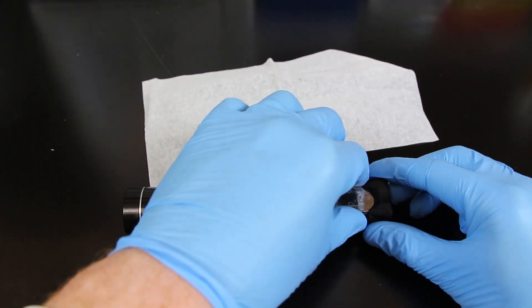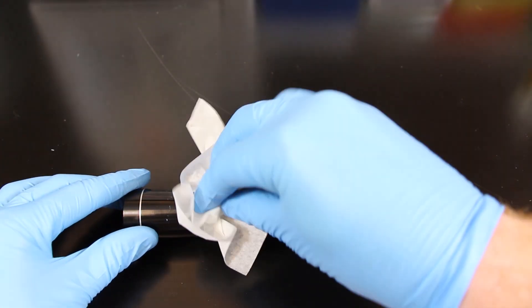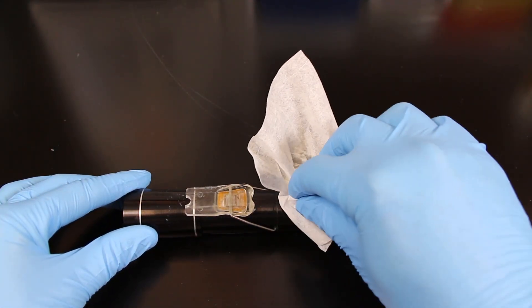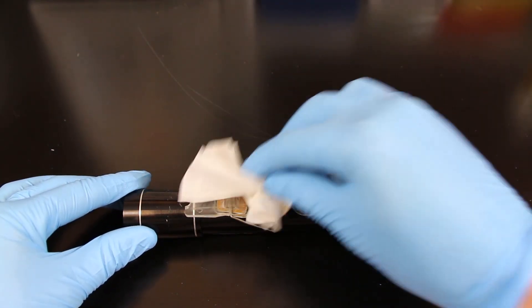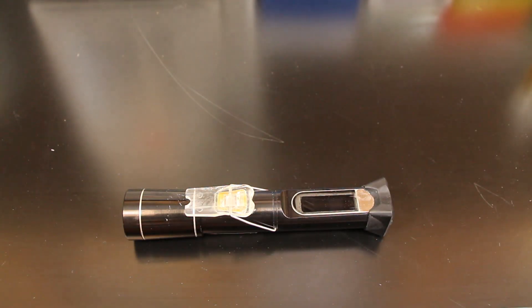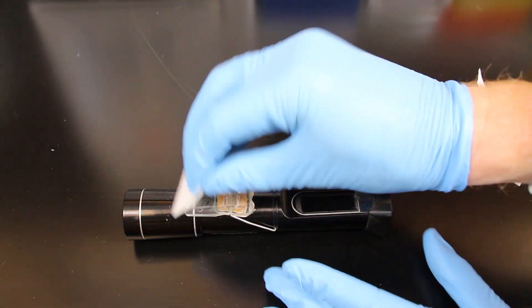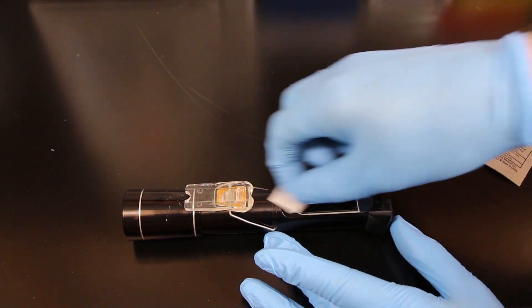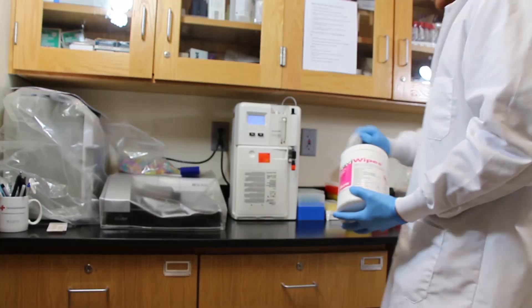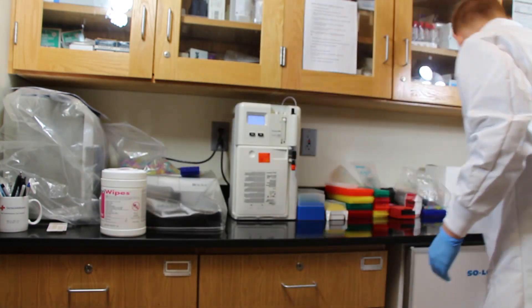Once you've finished the measurement and written down your value, open the top of the refractometer and take some sort of tissue like a chem wipe — something that's not going to leave any dust particles behind, because you don't want to affect the next measurement — and soak up all the urine on the device. Then clean off the device with an alcohol swab and simply wait until the alcohol is completely evaporated before storing the device or trying to use it again. Be sure to also clean off the countertop underneath wherever you were working in case any urine got spilled.